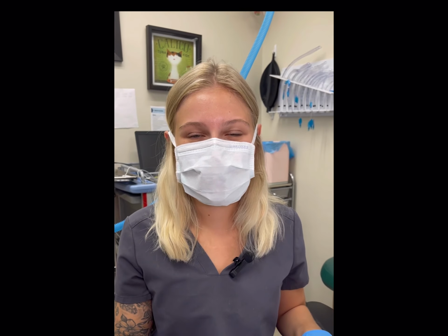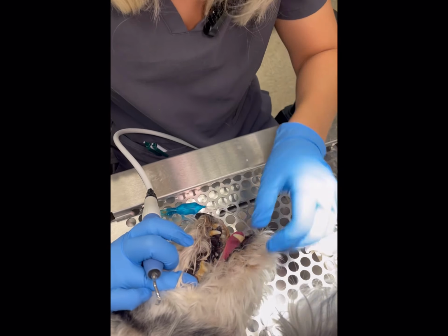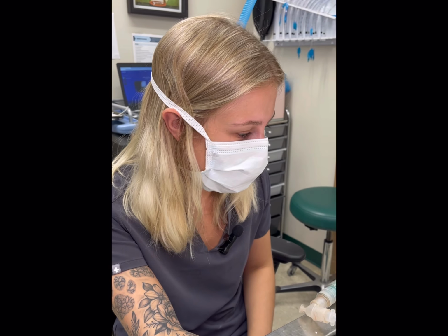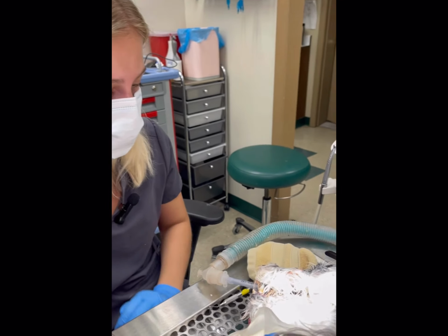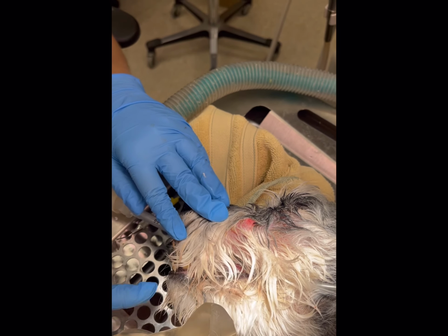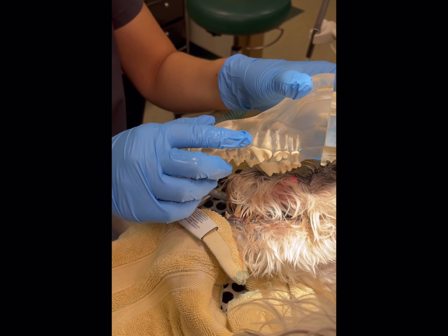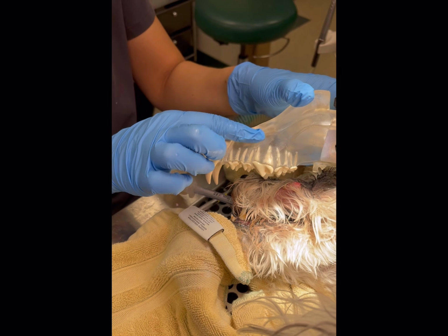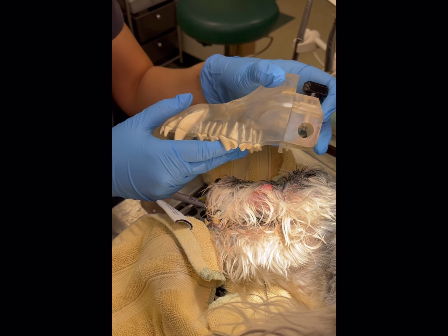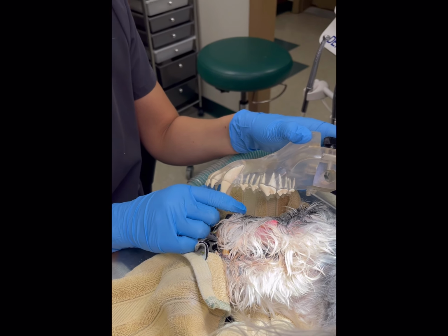We're gonna get started with Scamper's dental now. Okay, so Scamper here has a tooth root abscess. You can kind of see the swelling underneath of his eye. That usually occurs when the root tip of this tooth here gets infected, and it kind of lives right below the eye, so that's why you see the swelling underneath of the eye. So to fix that, that tooth needs to be extracted. So that's what we're gonna go ahead and do for Scamper today.